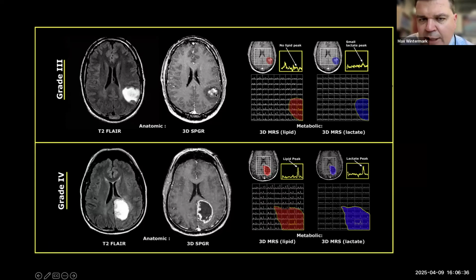And so that means that if we have a lesion that is really superficial and close to the skull and the bone marrow, it may be hard to interrogate by spectroscopy, because invariably, when you position your voxel, you're going to capture a little bit of the fat of the bone marrow, and then the spectrum that you will observe will be just a mess. Similarly, if the lesion itself contains a lot of blood products, it's also probably going to mess up your spectroscopy.